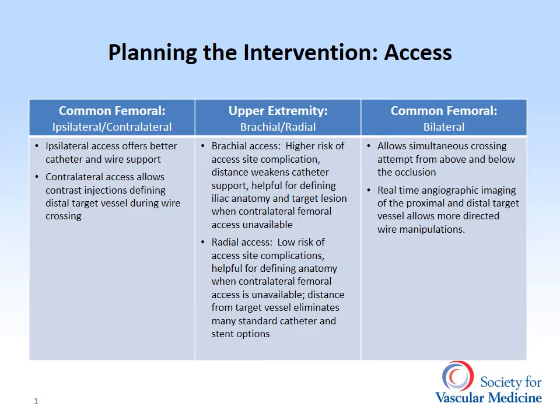Ipsilateral access offers better catheter and wire support, while contralateral access allows contrast injections that define the distal target vessel during wire crossing.